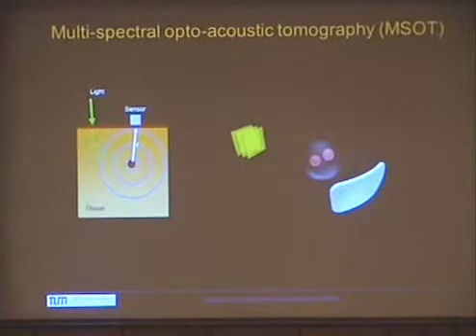And it sounds a little bit out of reality, but this is a very practical technique. It's been done since the 70s. And the issue here is that because we're using sound now, we do not care about photon scattering anymore. We can have optical imaging without caring about the photon scattering, which is the major problem. You see a 3D of this.